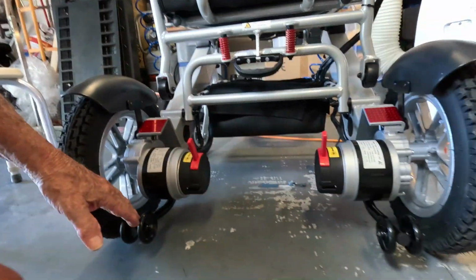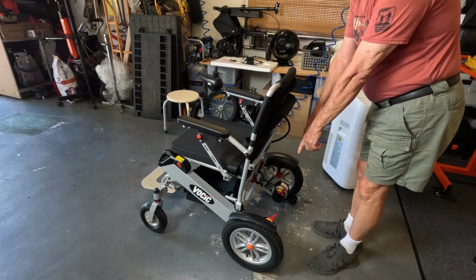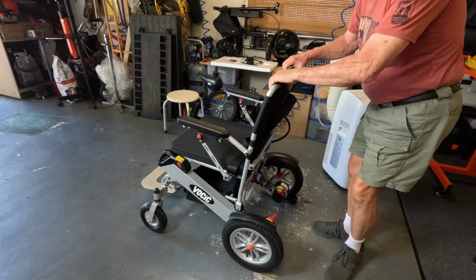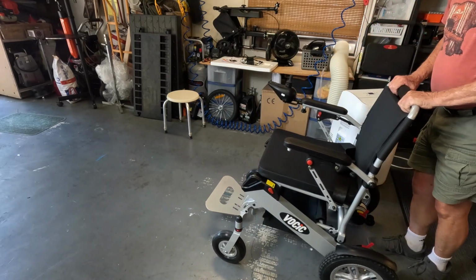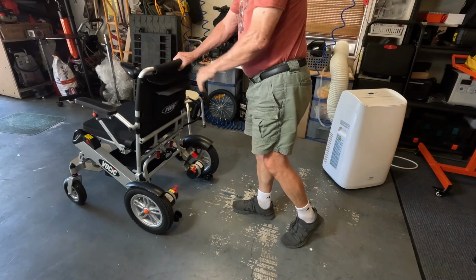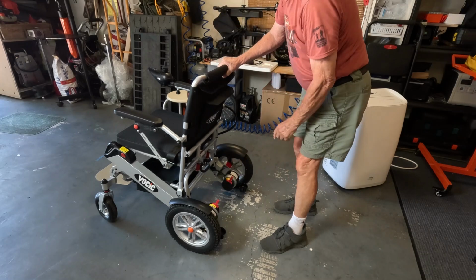And you see how that's going to keep it from tipping back. We haven't taken the motors out of neutral so it can be pushed. And this is how you could push a person in here just as a regular wheelchair, as long as both of these are in this position.